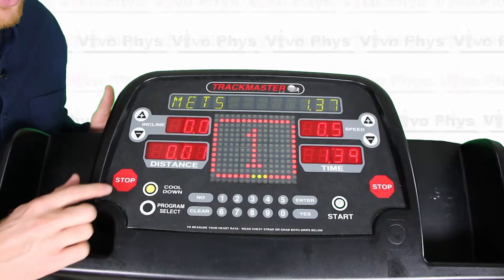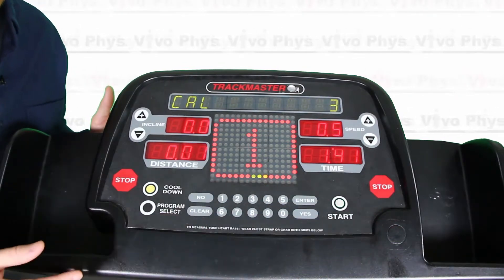When you're done on the treadmill and you want to stop it, all you have to do is hit one of these two stop buttons and it's going to stop the treadmill.